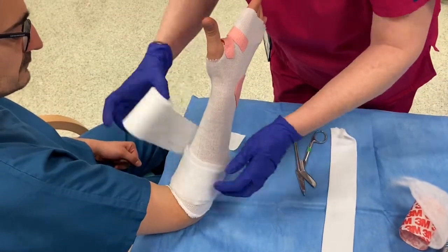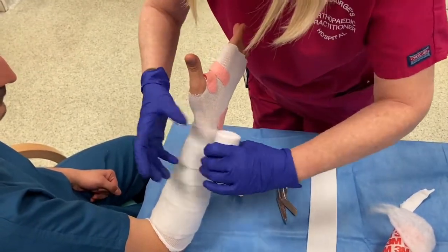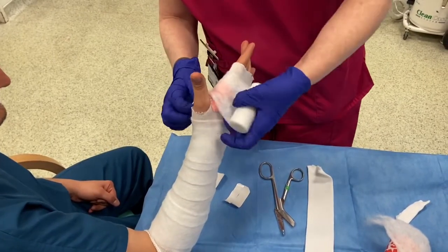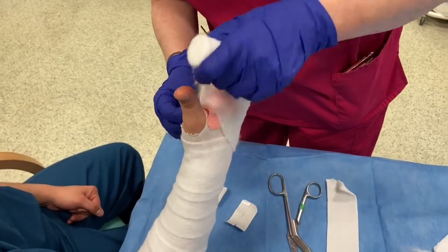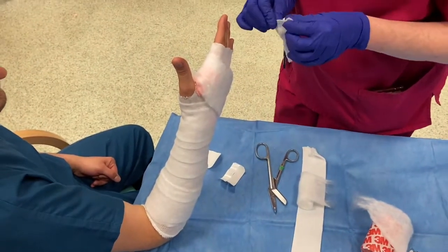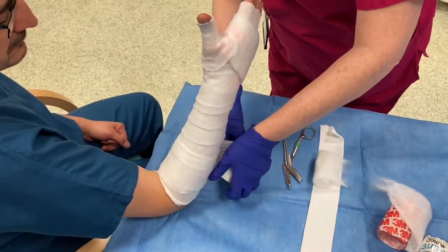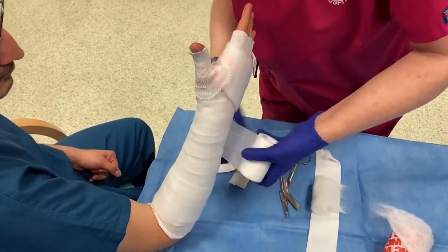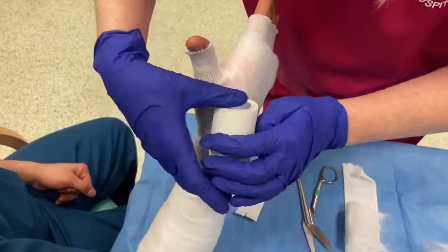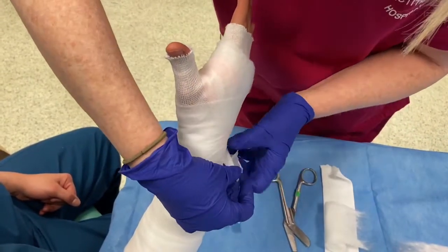Just as with the back slab, a wool bandage is wrapped around the forearm, overlapping 50 percent each time. It is even more critical with the application of the fibreglass to make sure there are no kinks and bumps in it, as these will be there for several weeks and run the risk of creating pressure points. Sometimes, but not always, a fine elasticated paper layer is applied as this makes the whole bandage a little bit smoother and easier to handle. This step isn't essential and you won't always see it being done.